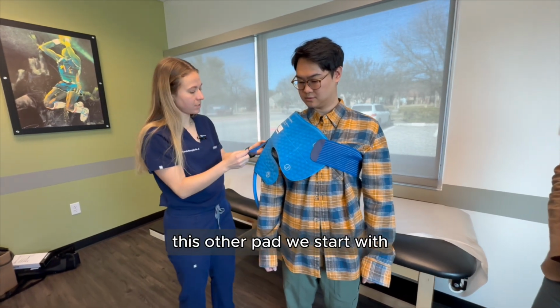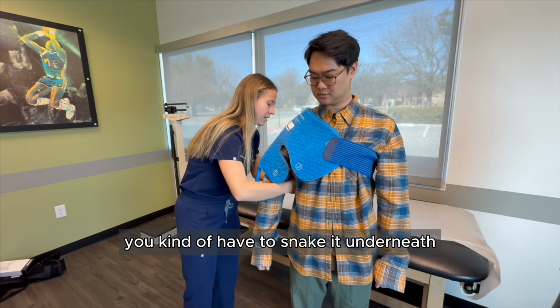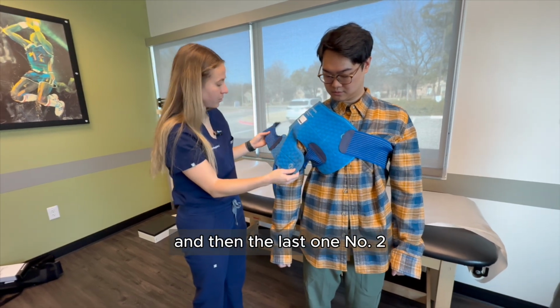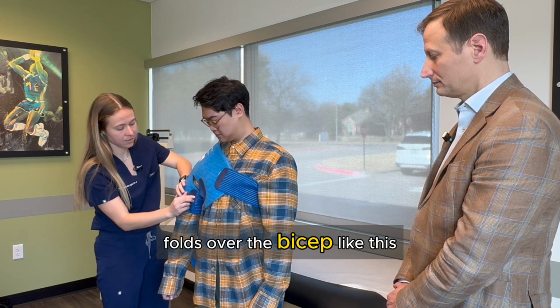This other pad, we start with number 3, goes underneath the arm. You kind of have to snake it underneath. And it attaches to that number 3. And then the last one, number 2, folds over the bicep like this.